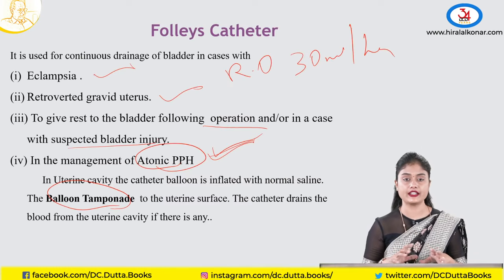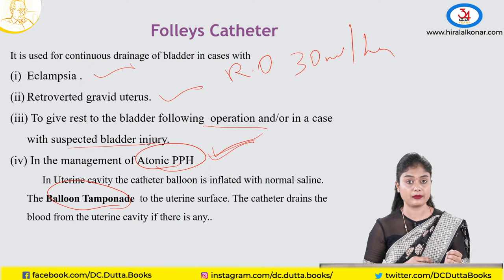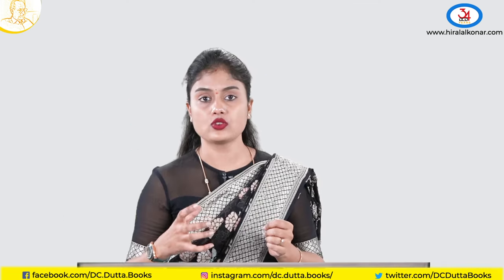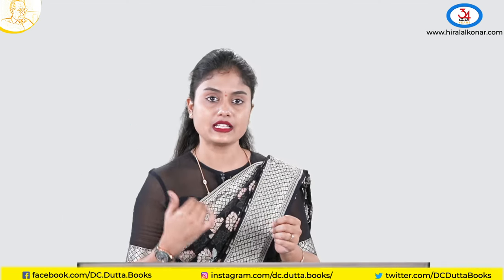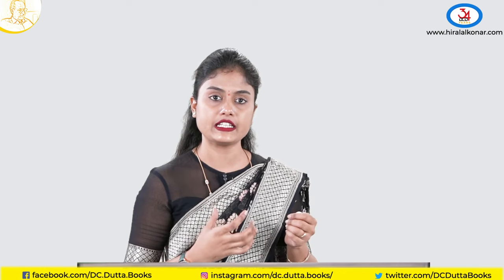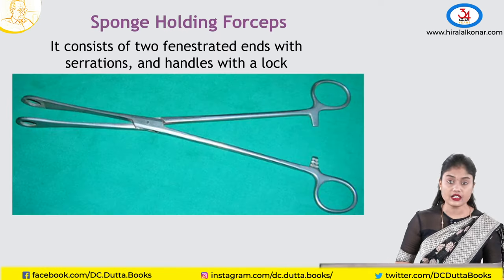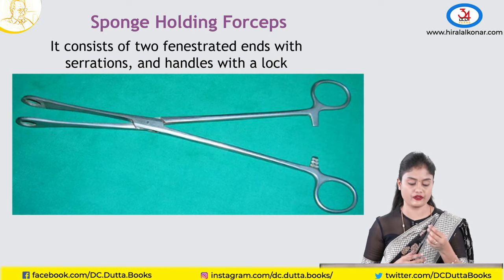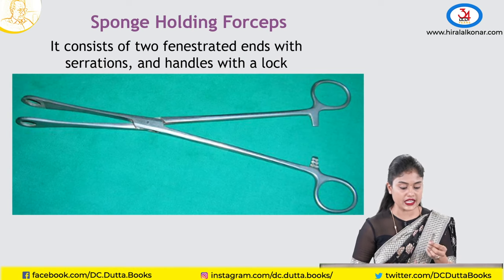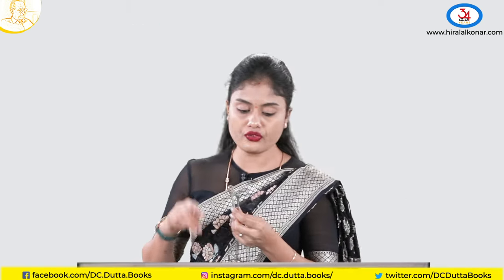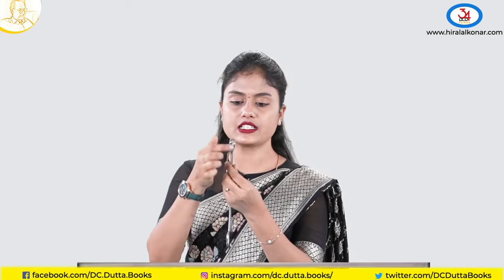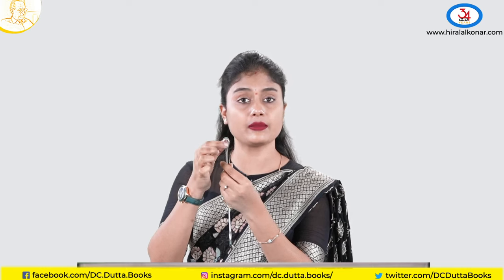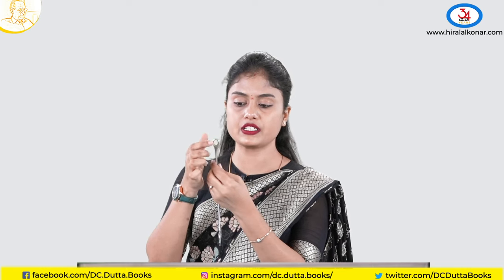So we now know about the bladder and its instruments — draining the bladder in labour makes descent easier and faster. Coming to the sponge holding forceps. You can see it has two fenestrated ends — there are holes at the tip of the instrument. Fenestration means the gap or hole.